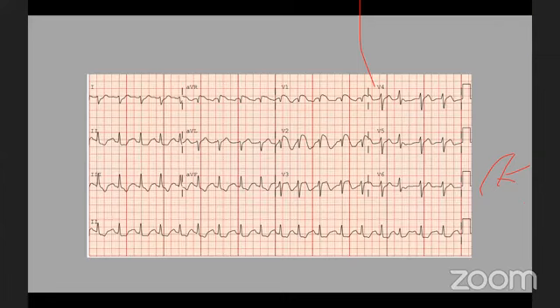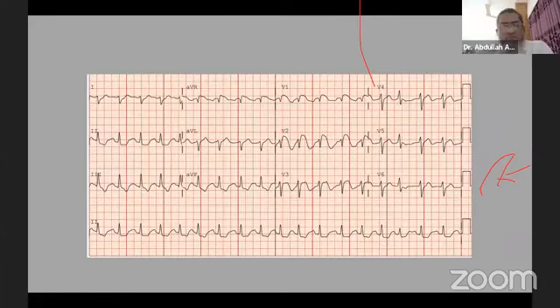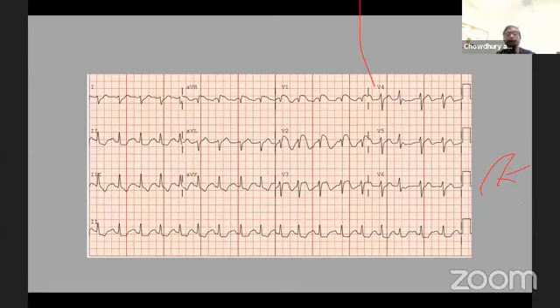Chest pain? Hafiz bhai? Try to exclude PE. Altered mentation. Try to exclude pulmonary embolism. Pulse ox was okay. Patient's heart rate is almost 100, right? So should we take the patient to the cath lab or not?